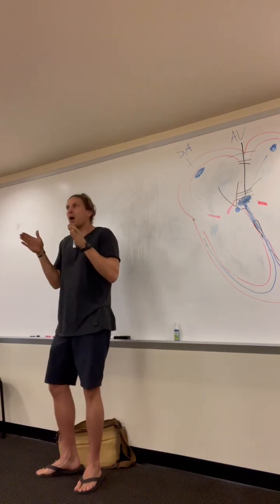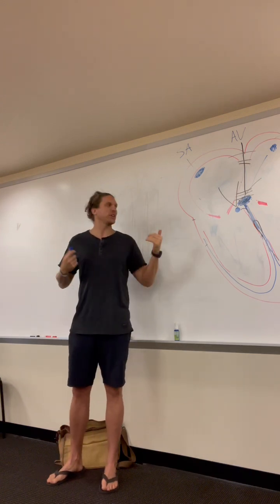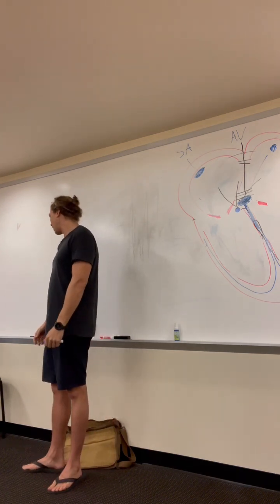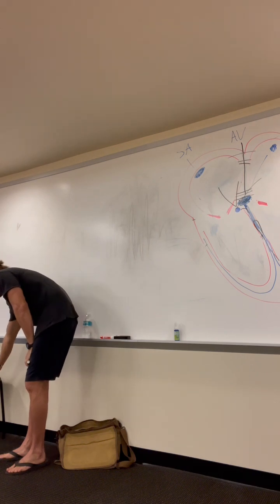Even though there is that pause after that early beat, it's just because your body naturally has to pause after the heartbeats to get ready for the next heartbeat. So that's not really a pause, it's your body's normal pause. Those are PACs, don't confuse those.